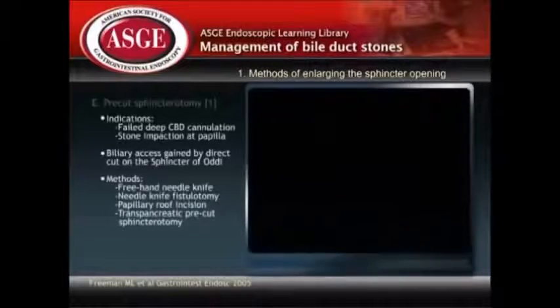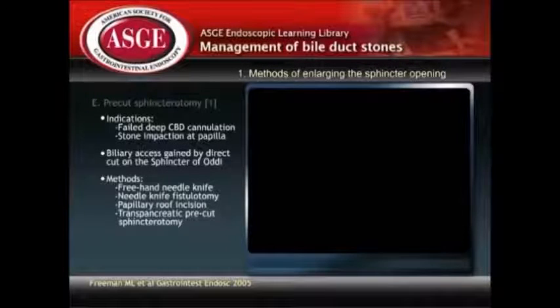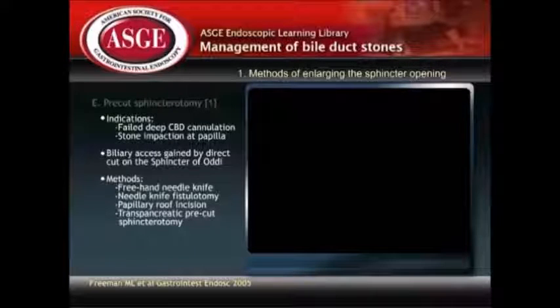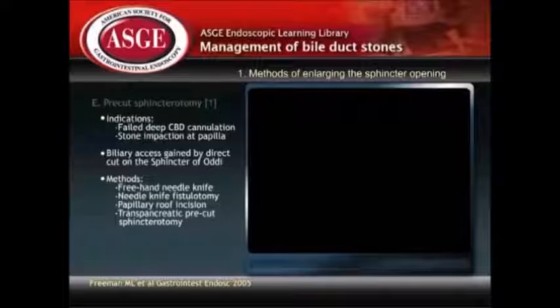Pre-cut sphincterotomy. The indications of pre-cut sphincterotomy include failure of deep CBD cannulation and stone impaction at the papilla. It aims to achieve deep cannulation and gain biliary access by direct cutting onto the papilla and sphincter orifice.